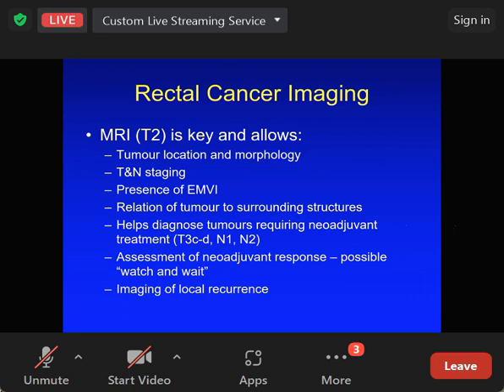That will dilute the contrast, and it won't actually help, because when the bowel is dilated, you've got fluid which is more or less equal to water, so it will show as dark compared to the enhancing bowel wall. So all you're doing is changing the bowel contents from dark relative to bowel wall to white. So you don't gain anything.